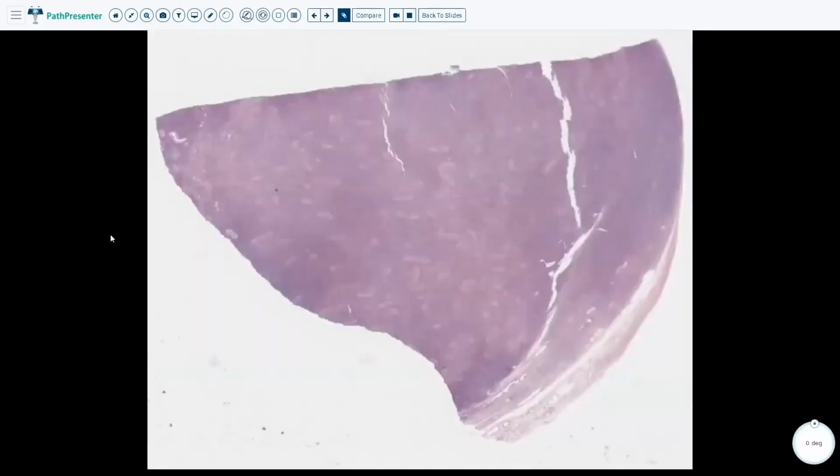Moving on to our last case of the day. So again, we are still within testicular lesions, and we can see that this is relatively blue. If you didn't know better, you would almost think maybe we have a section of a lymph node with maybe some germinal type centers, even though they're oddly shaped. So let's just go down and see what we have.